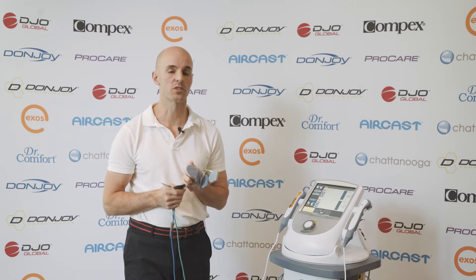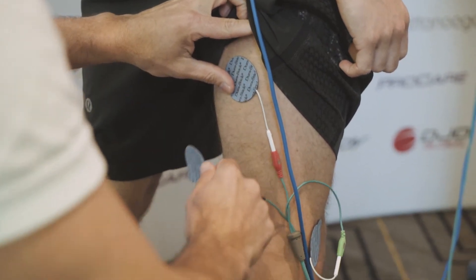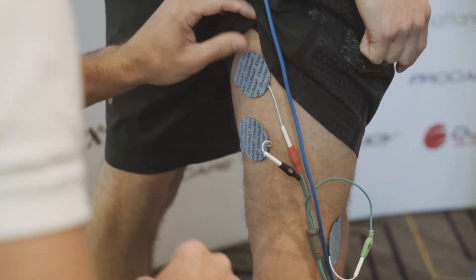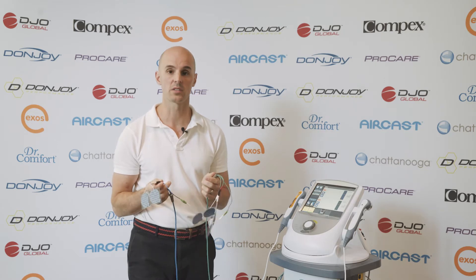It's something that we use all the time in the practice and it's been very useful. What it allows us to do is measure the electrical activity in a muscle group, and better still, when we've got two channels, it allows us to measure the activity in one muscle group compared to another — and that's where it becomes very useful.